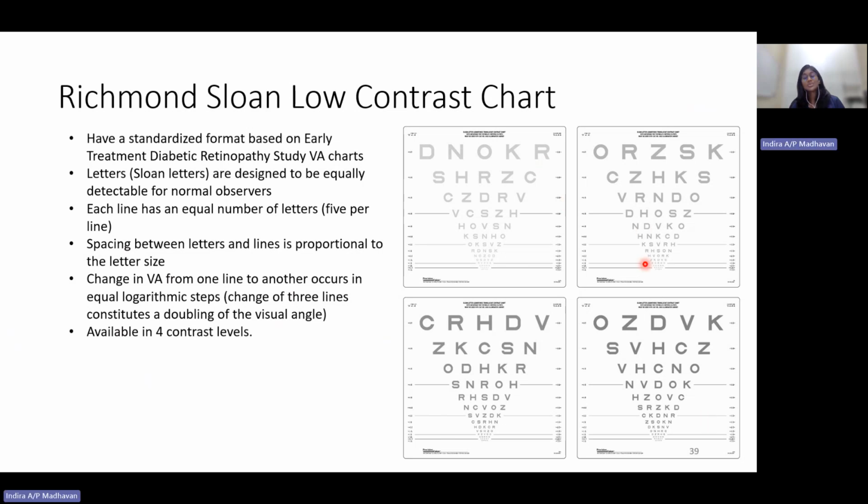Okay, and when you use any of the contrast sensitivity charts, you cannot touch the chart. Just remember, our chart and also our Pelli-Robson chart in the clinic are actually already contaminated because students have been pointing out the letters. But supposedly, when it comes to a contrast sensitivity chart, you shouldn't touch the chart because your fingers might contaminate it.